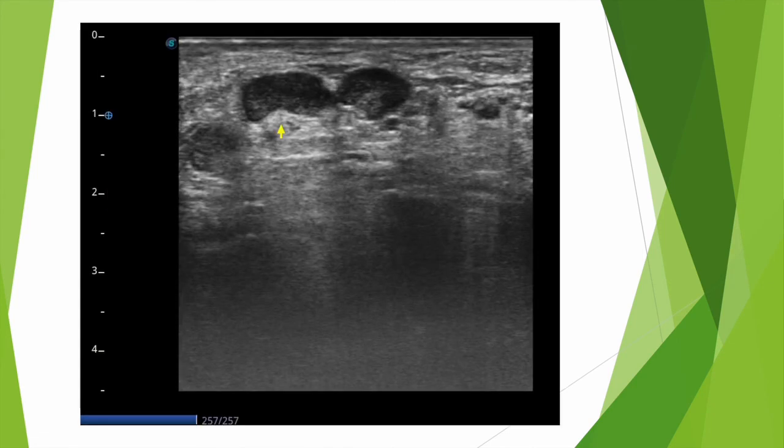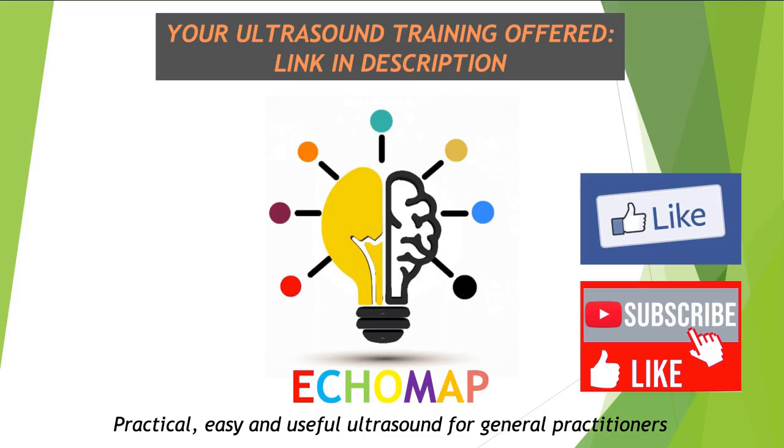And for this lymphadenopathy, you might think it's more typical, but again, there's disappearance of the central hilum in both of these lymphadenopathies, and a shape that is gradually becoming more rounded. Especially even for this one, which is no longer quite twice as long as it is thick, but mainly for that one. So, two lymphadenopathies that are starting to become round and have lost their classic appearance of a central hilum. So this patient was biopsied, and it turned out to be a lymphoma, a 66-year-old patient who had lymphoma.